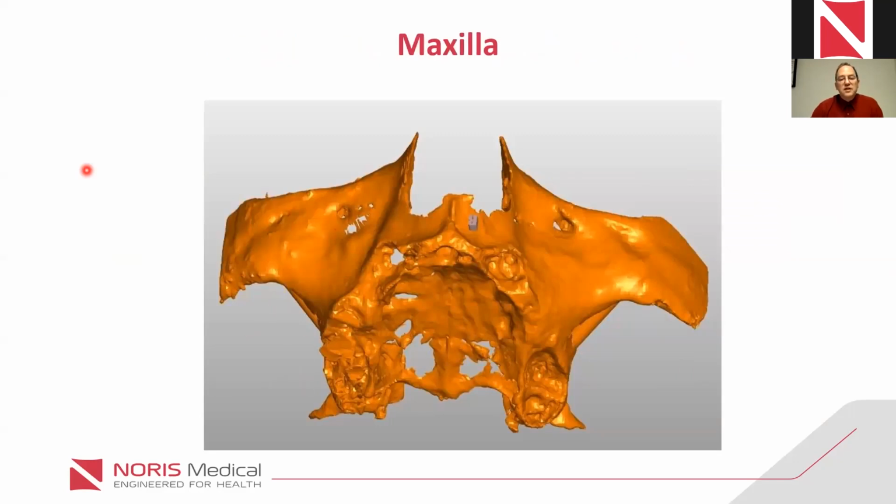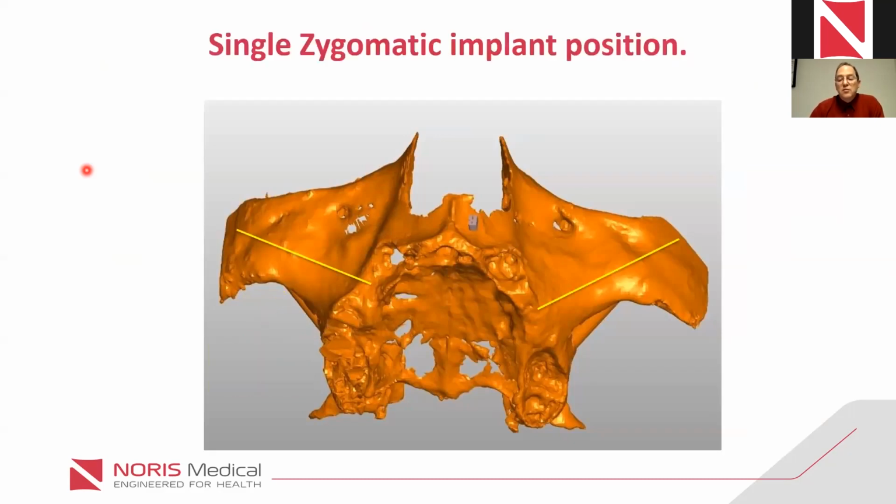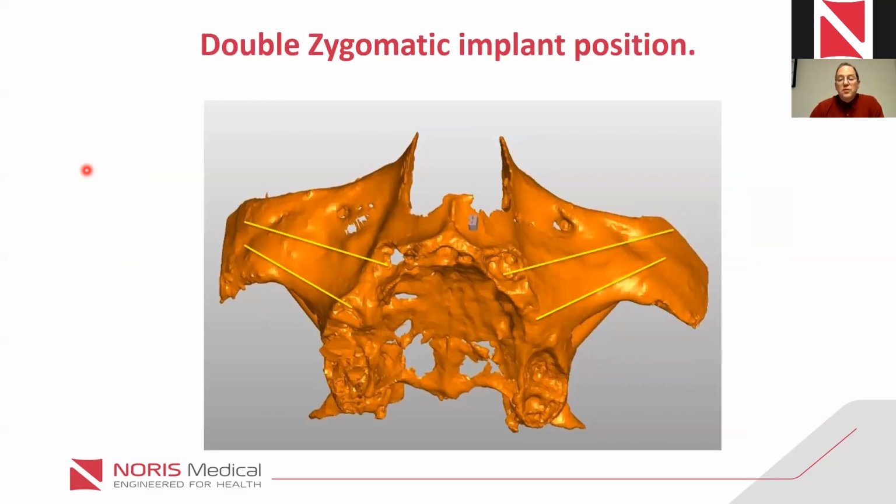This is showing us basically the angles we have for zygomatic implants. So we can have a hybrid implant, position second premolar, aiming towards the zygoma notch. We can have double zygoma, where the anterior implant would be at the area of the canine, and the apex would be as close to something like 5, 7, depends on the anatomy, but as close as possible that we can put it, as close as possible to the orbital rim.